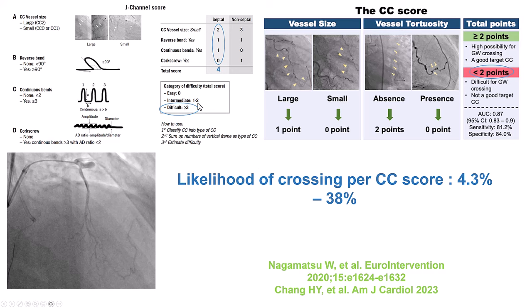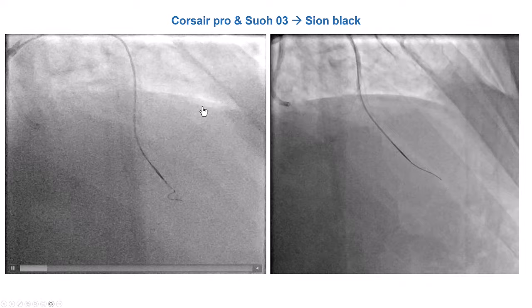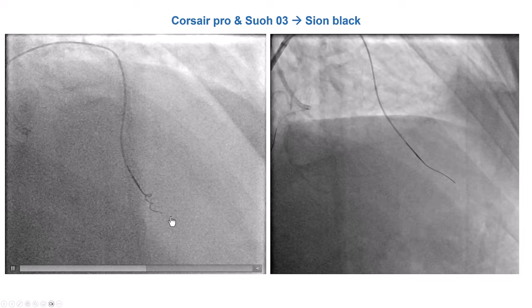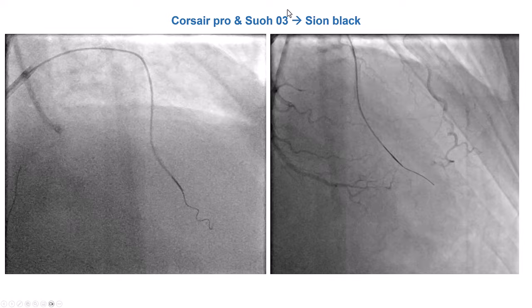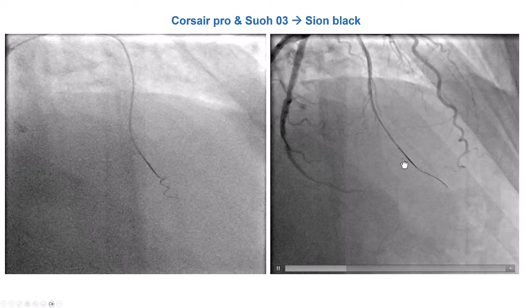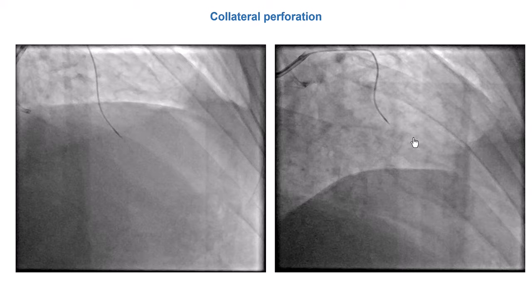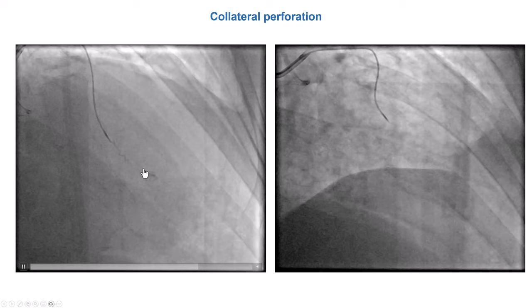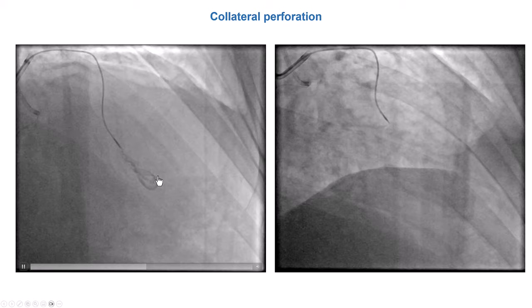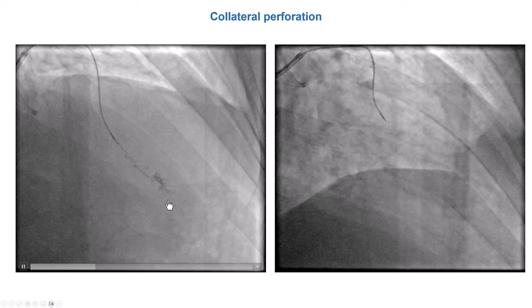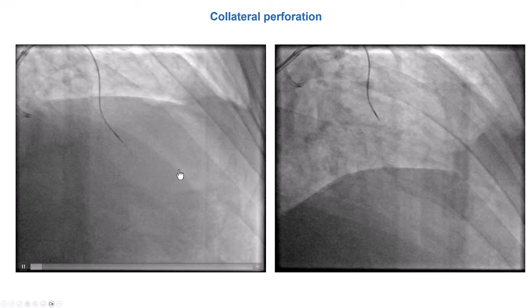We tried with a SUO-03 guidewire, which is less traumatic, but it had difficulty advancing. We then switched to a soft polymer-jacketed wire, a Sion Black, which seemed to advance along the course of the vessel. We advanced our microcatheter, but retrospectively that was not the right thing to do — when we took a picture, we saw that we had perforated the collateral. Fortunately, because this was a septal collateral, the perforation was draining into a cavity. We can see this because the dye was clearing very quickly. Had it been epicardial, we would have been much more concerned, but here we were much less concerned.